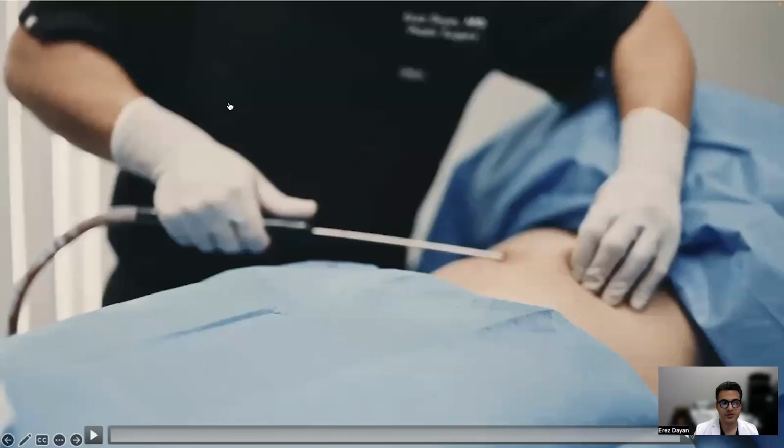Here again, I'm going to show you liposuction technique. This is a regular suction-assisted cannula.